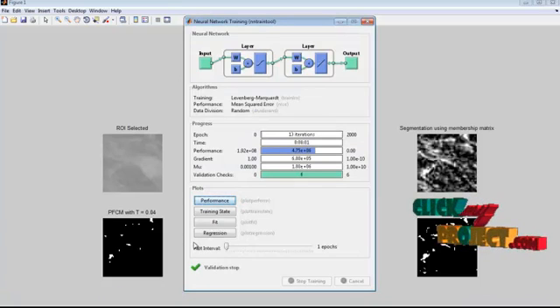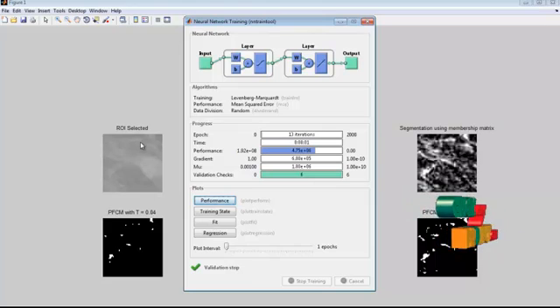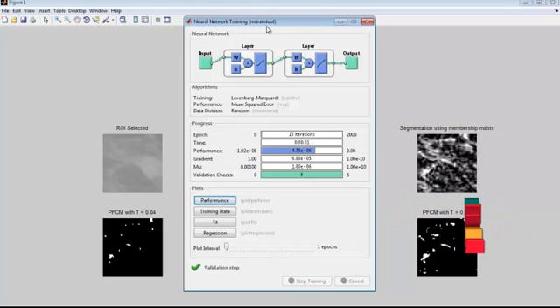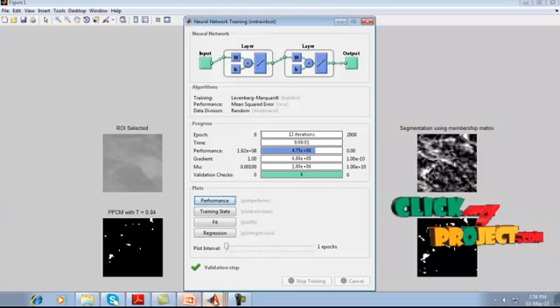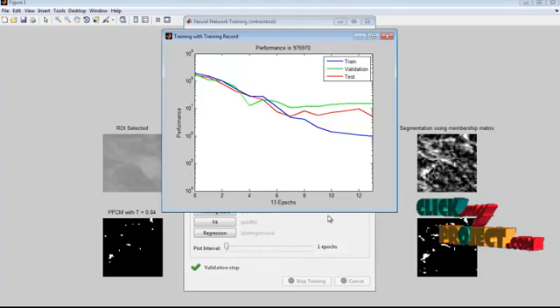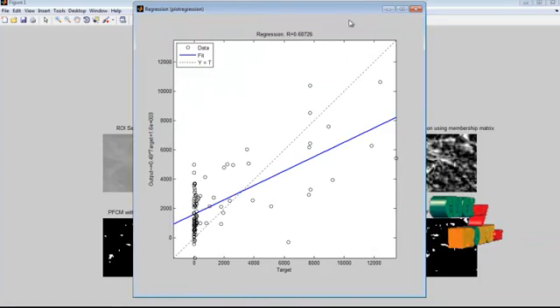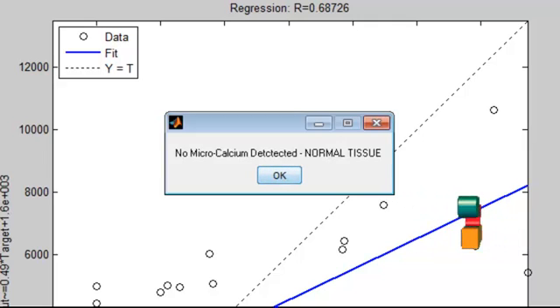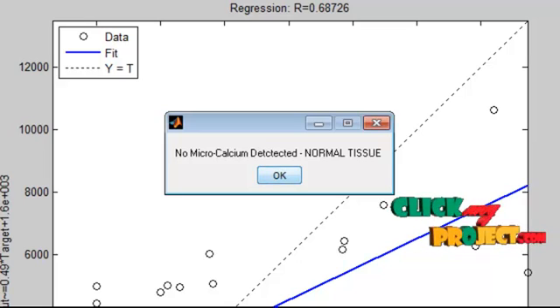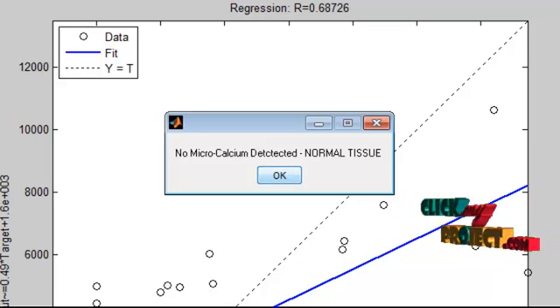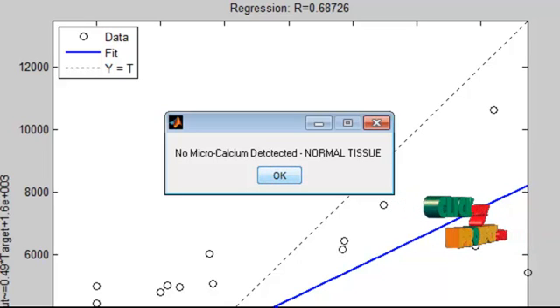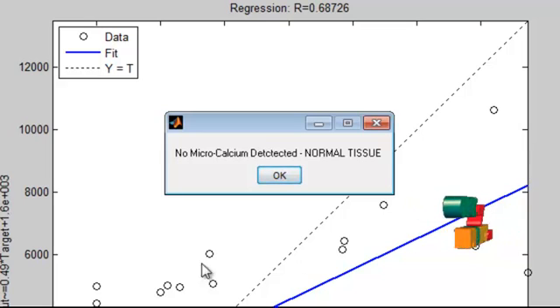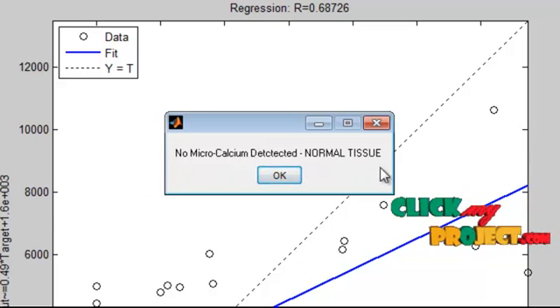Features are extracted from the selected region of interest and a feature vector is created, which is provided to the neural network. Training is performed and the neural network outputs are shown. Based on the neural network generated pattern, it classifies into micro calcium or normal tissue. This region of interest has been classified as normal tissue, so a message is displayed: 'No micro calcium is detected.'